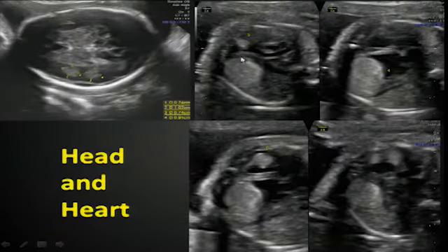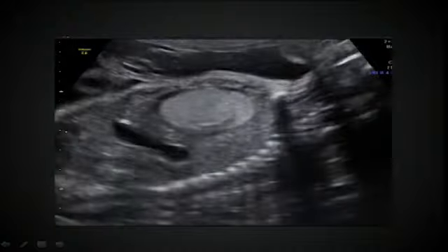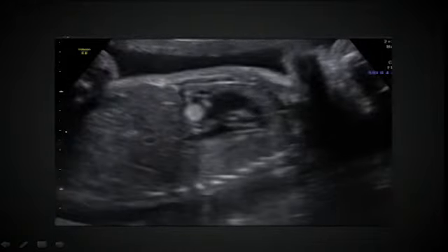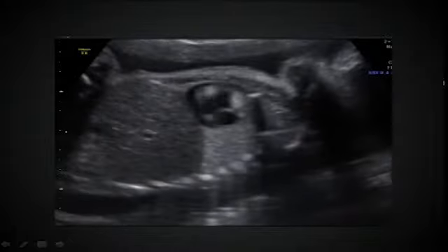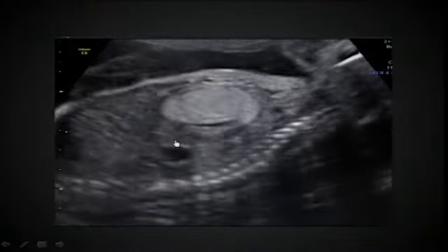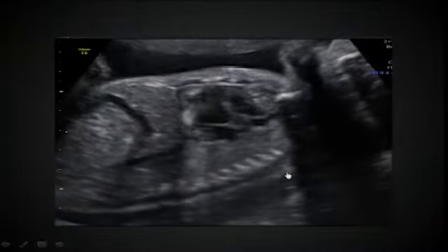You see I've got these little numbers on here. It's wonderful when the machine labels it. It'd be great if it could do it automatically. But you can see I've actually counted 5 different little echogenic collections. And this is looking at that sagittal scan from left to right. So the diaphragm is intact. So again, left, so we're over here by the stomach. There's diaphragm. We're going through the heart.